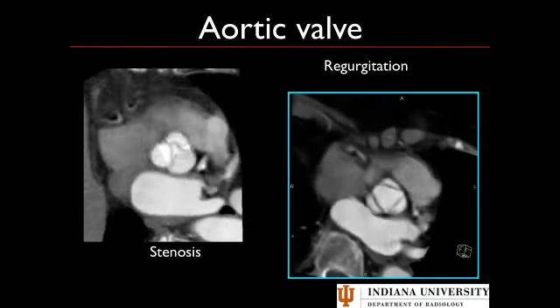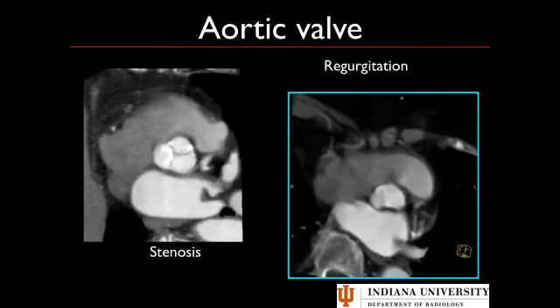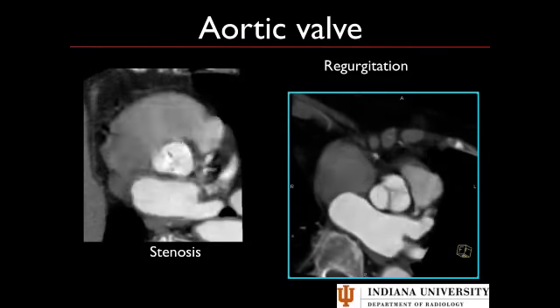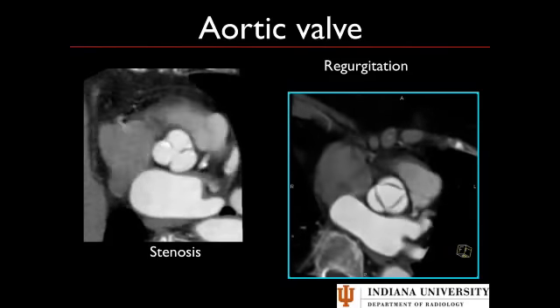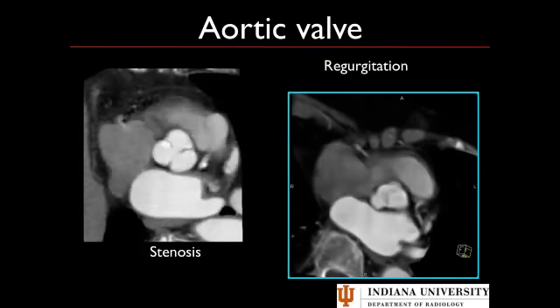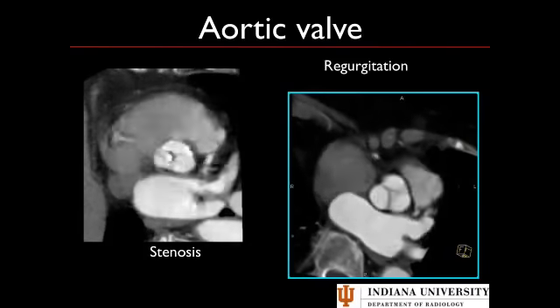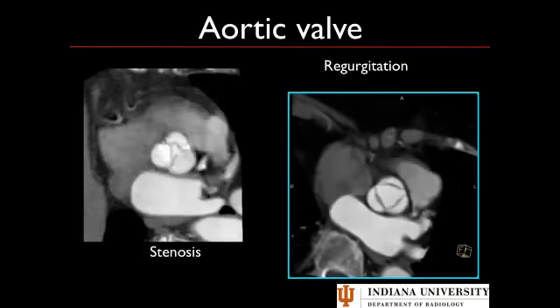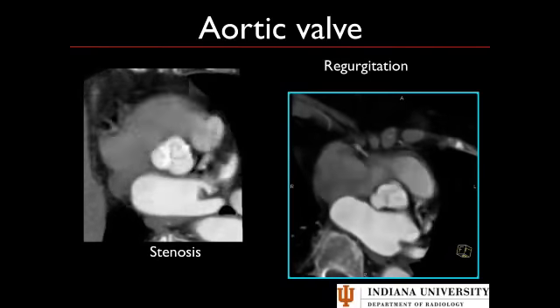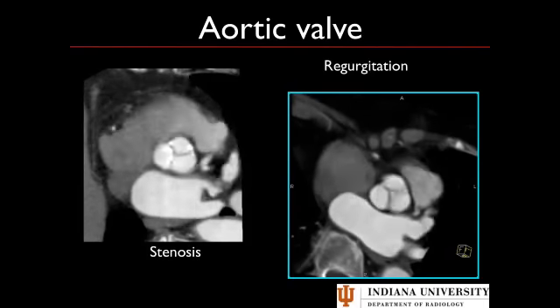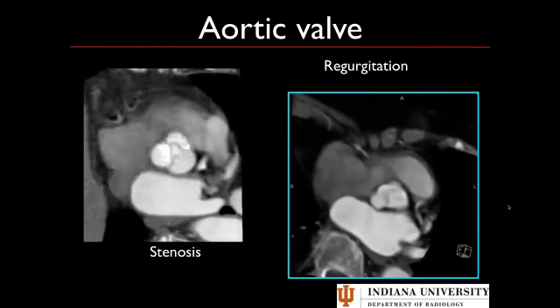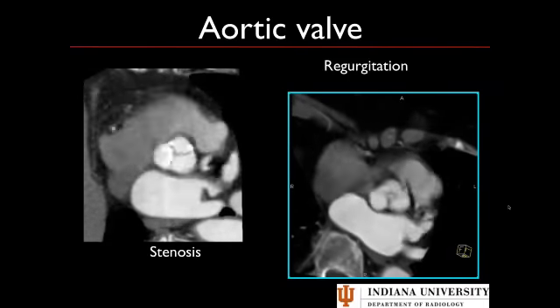Here we have two movies showing the aortic valve. On the left is a calcified aortic valve — you can see the valve is not opening very well, consistent with aortic stenosis. We can scroll up and down to find the tightest area and measure it by planimetry to categorize the stenosis as mild, moderate, or severe. On the right, the leaflets never actually touch, and that little hole in the middle is consistent with aortic regurgitation.